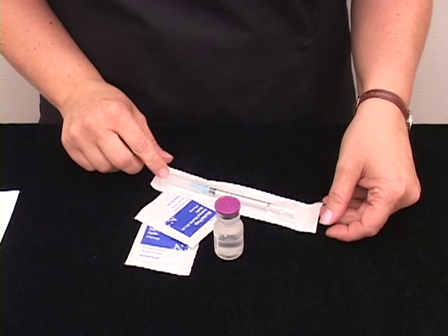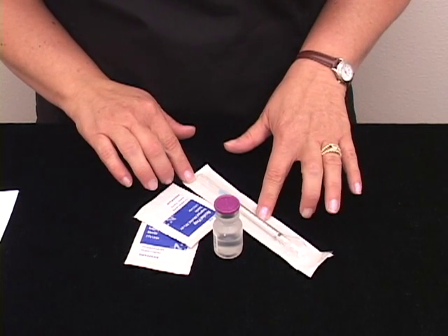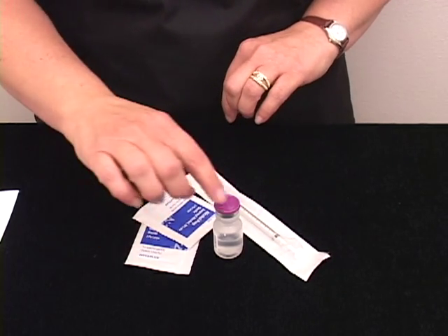To prepare for a sub-Q infusion, gather your supplies. They'll include your syringe, alcohol swabs, and your vial of medicine.